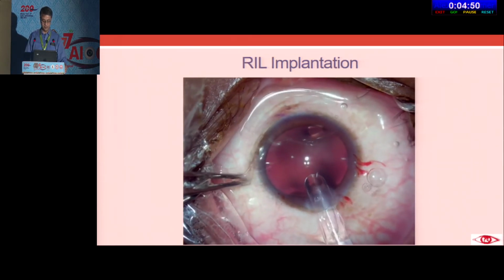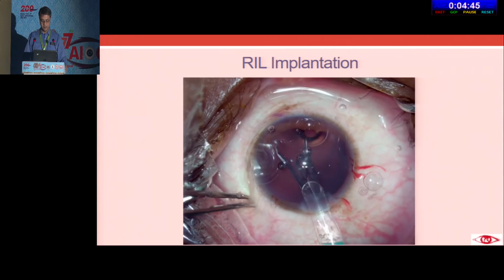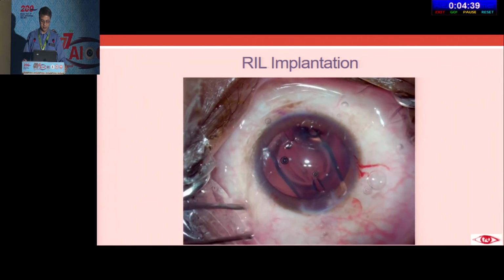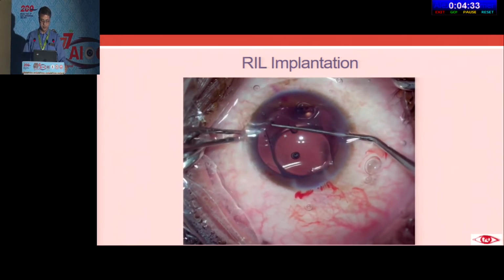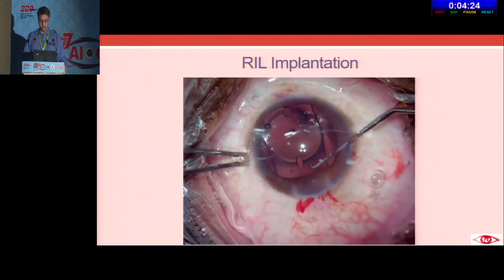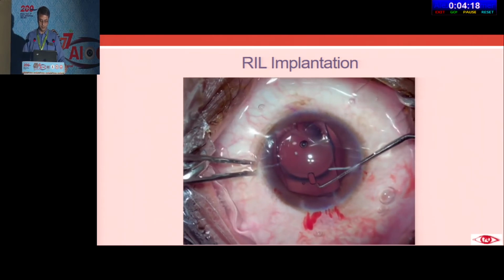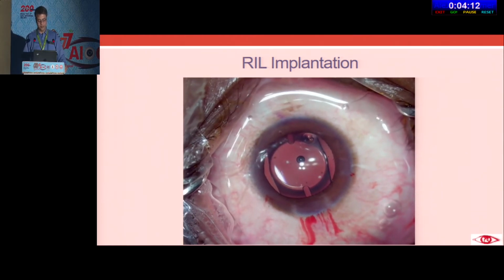This is the surgery, as you can see, very short part of it. You've seen the more detailed one in the previous one. So I do it with viscoelastics, and this is a 2.8 incision actually, and very, very simple. I like this compared to ICL because of the loading. The loading in ICLs is harrowing. You're so worried that it's going to tear when you pull it from the front nozzle. And there it's done. I think those surgeries are probably done superior. I do my surgeries temporal, so I don't have to rotate my lens or anything at all.